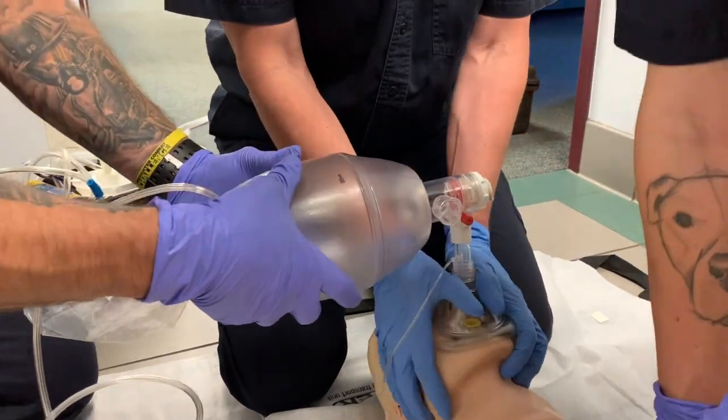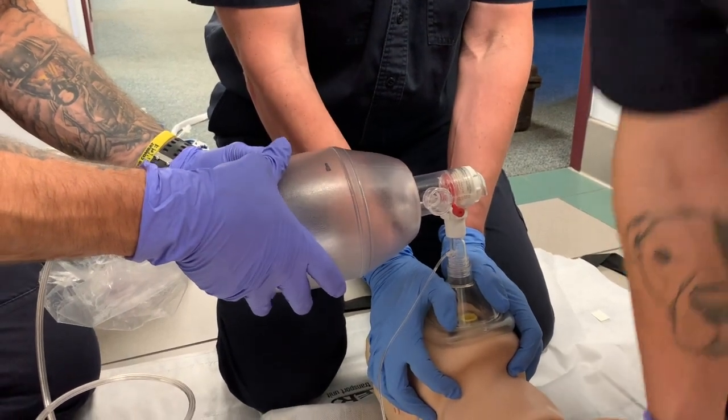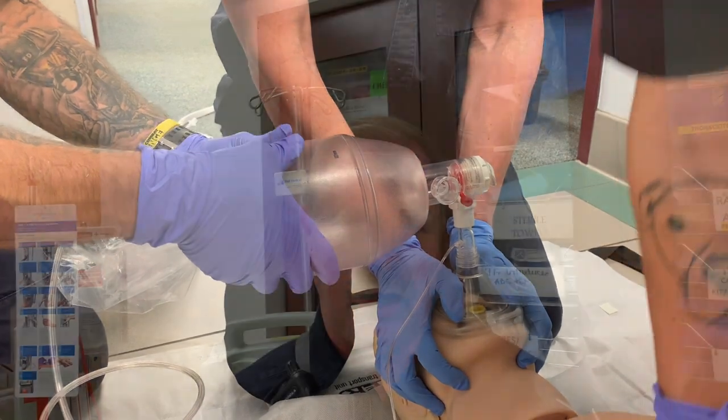We are recommending 2-person bag valve mask ventilation, with the person at the head of the patient applying the thumbs down technique, while the person at the side of the patient is squeezing the bag once every 6 seconds, taking about a second to squeeze the bag and using about 1/3 to 1/2 the volume of an adult BVM on an adult patient. The person who is ventilating the patient is responsible for watching the end-tidal CO2 channel, and if there is a sudden change, either an increase or decrease in that number, to make sure that the lead paramedic is notified.